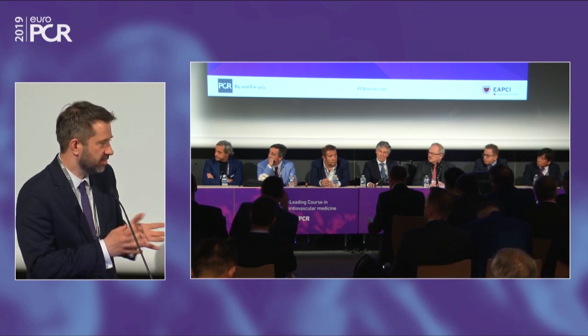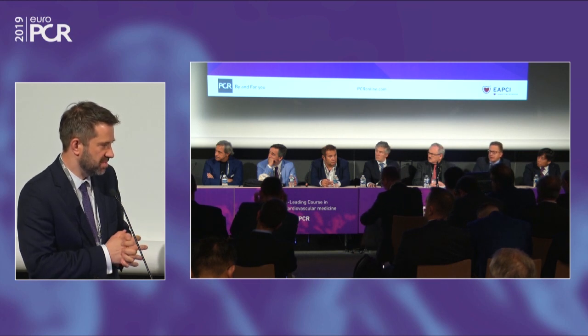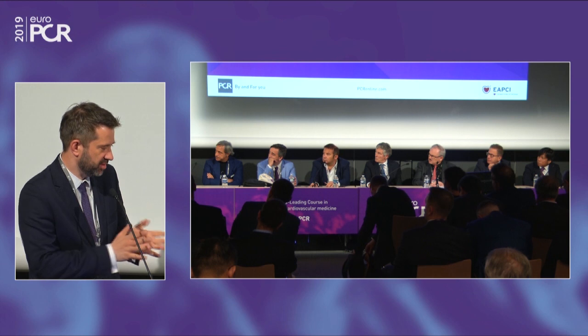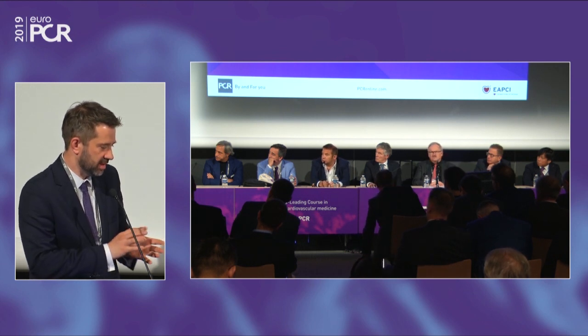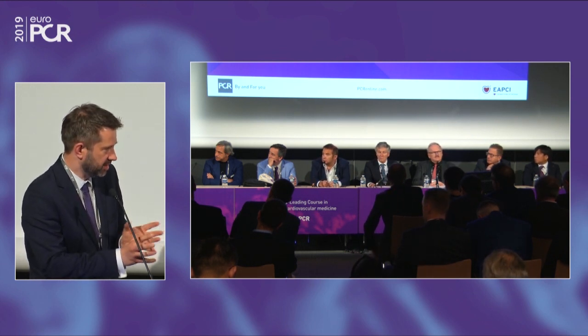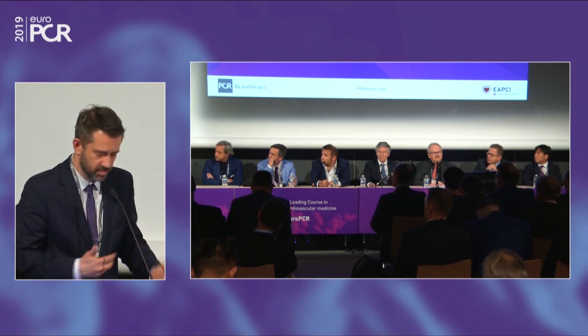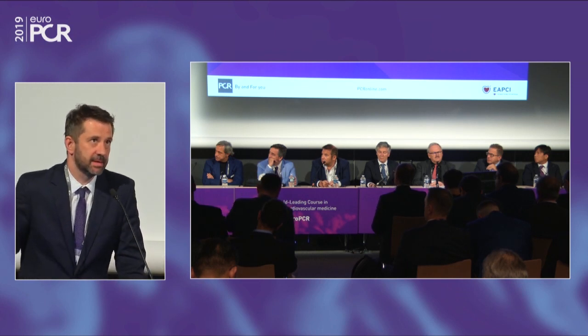Guide wire, sometimes, of course, I agree, may complicate the positioning. Of course, the movement of the stent is also, let's say, more.